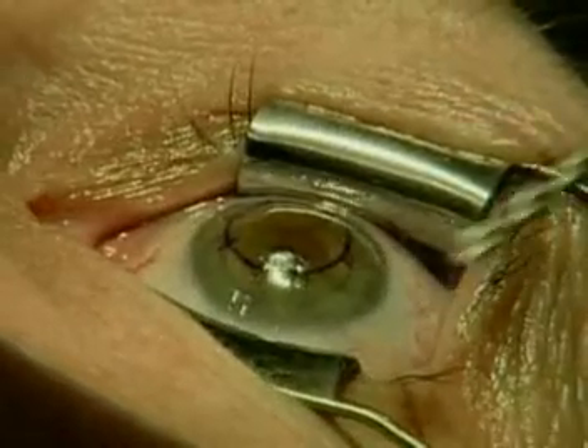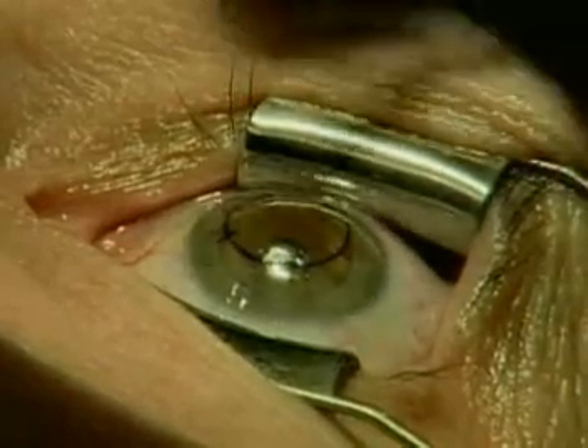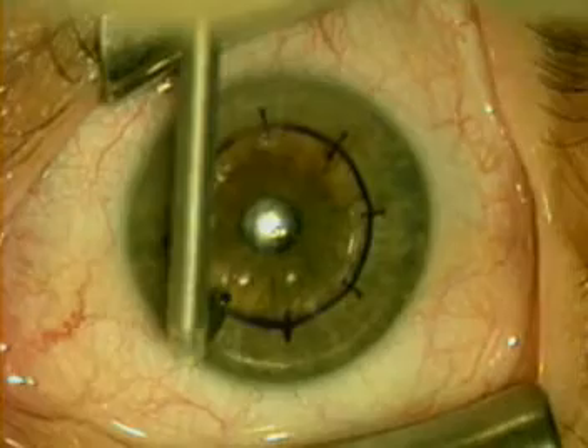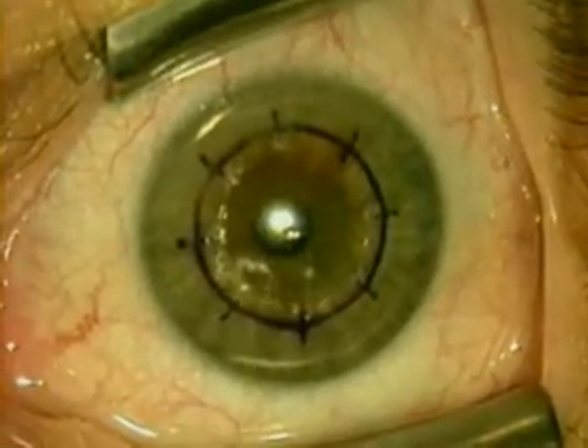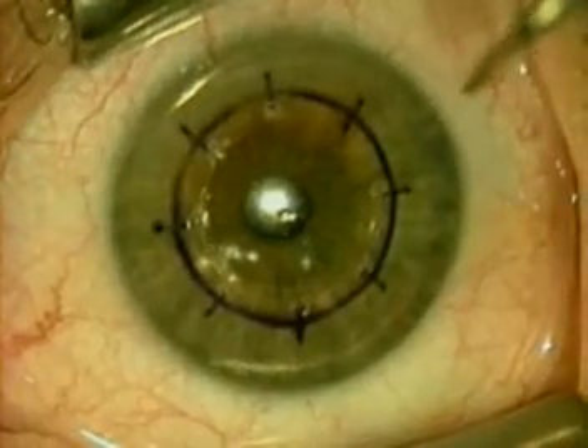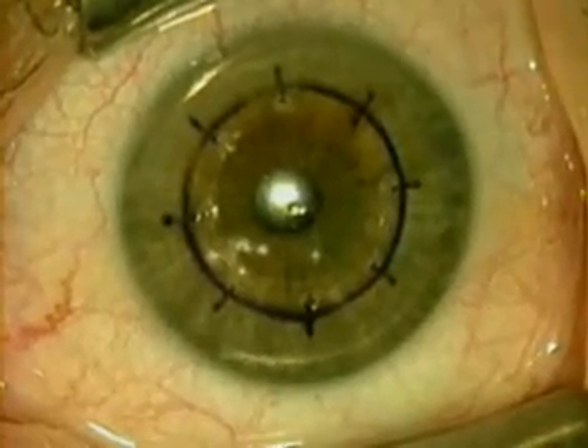Following the seven and six millimeter zones, we treat the eight millimeter zone. In cases of higher treatments, there are 32 spot treatments where we also apply an additional treatment application in between the hash marks and at the seven millimeter zone.